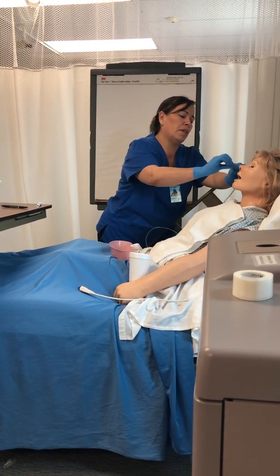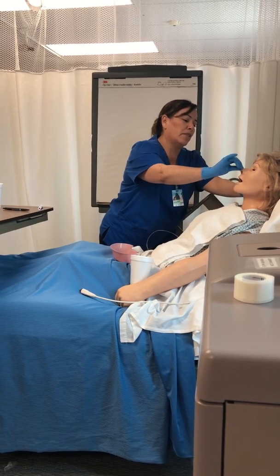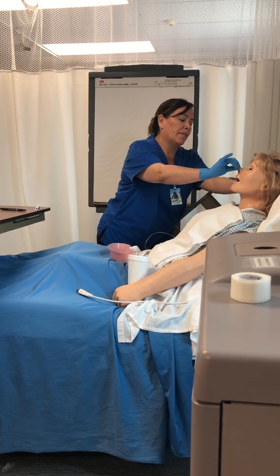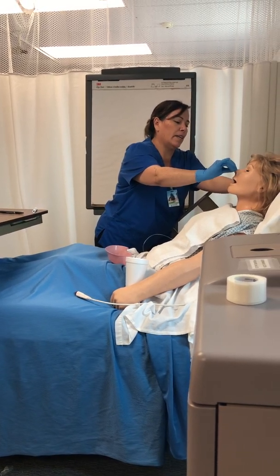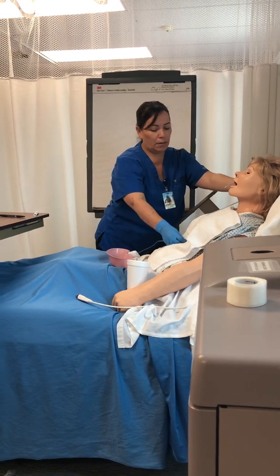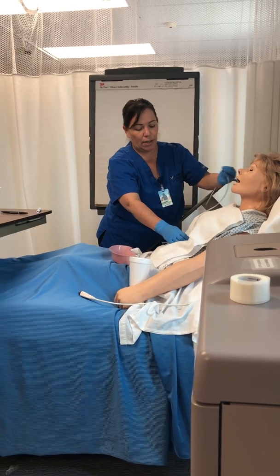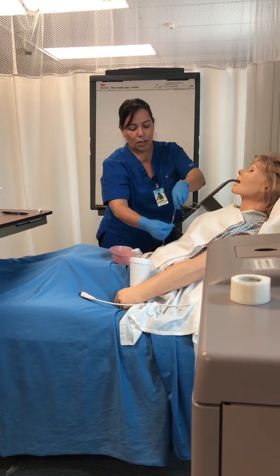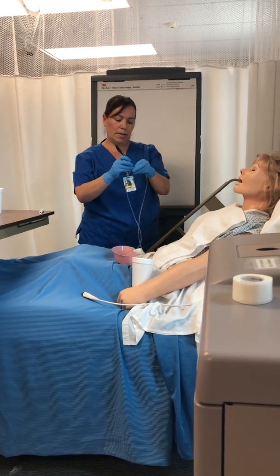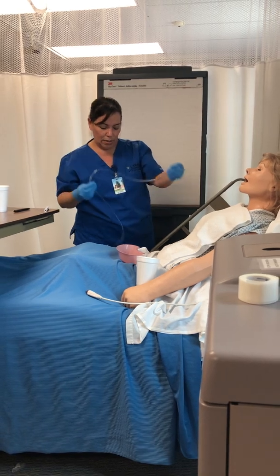Okay, so you measure the tube from the tip of the nose to the ear lobe, and then down to the xiphoid process, and then you add 10 centimeters. Okay, so then you mark the tubing, right here.